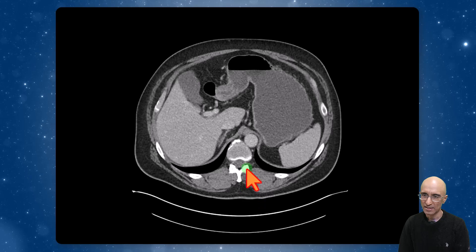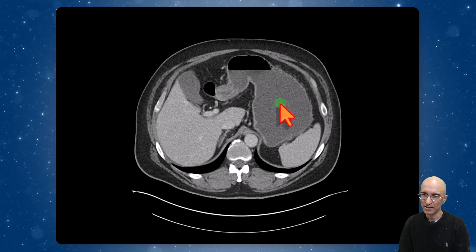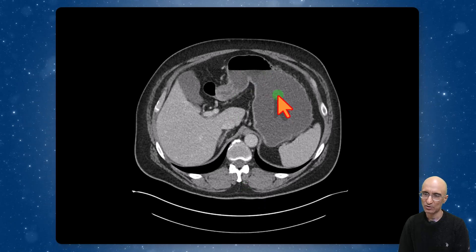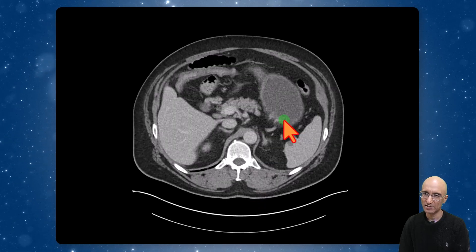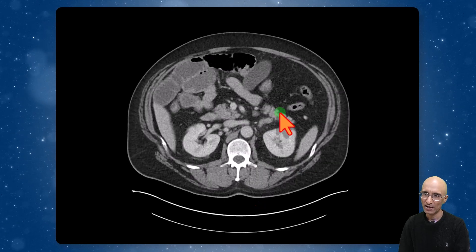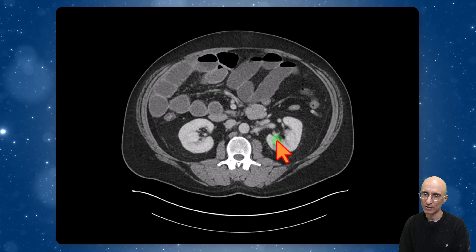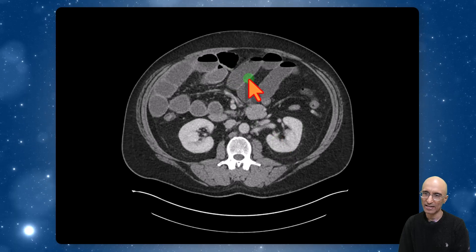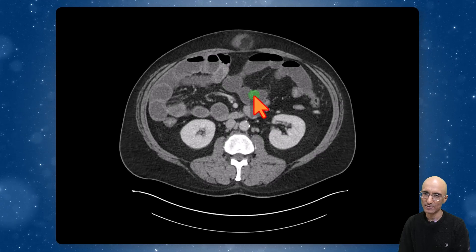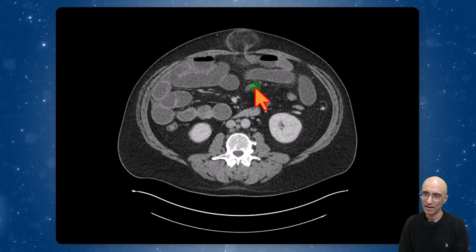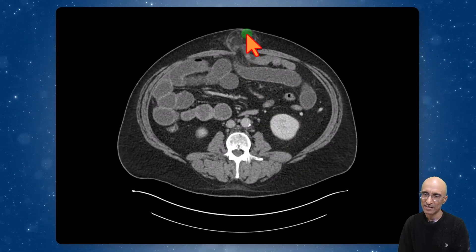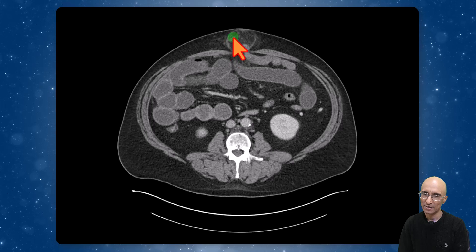On the CT examination we can clearly see the stomach is distended and fluid filled. As I scroll down we can see dilated fluid-filled small bowel loops, and we can also see an umbilical hernia.